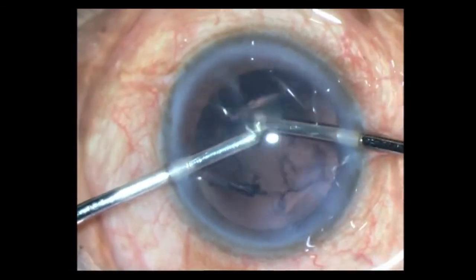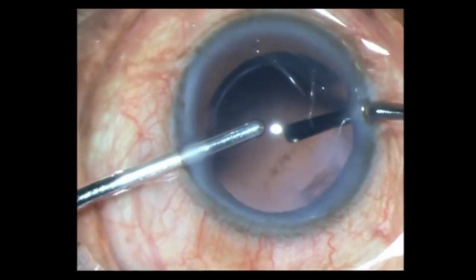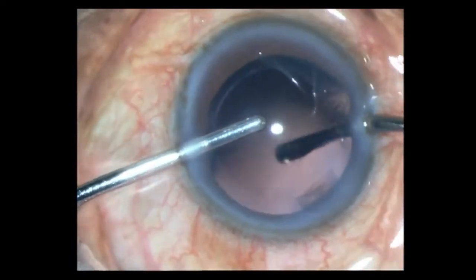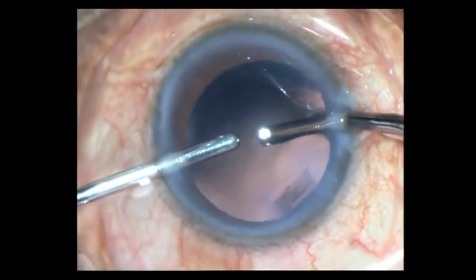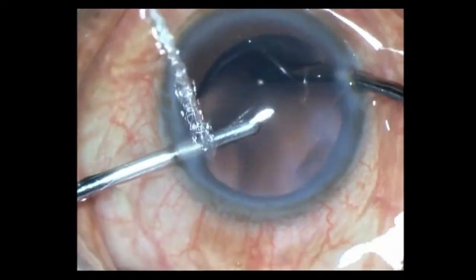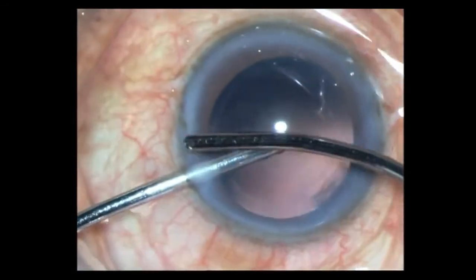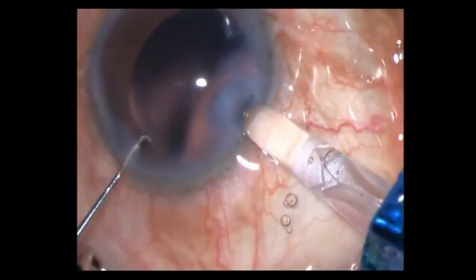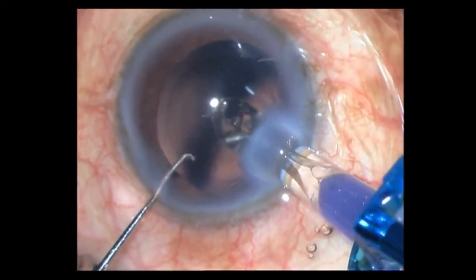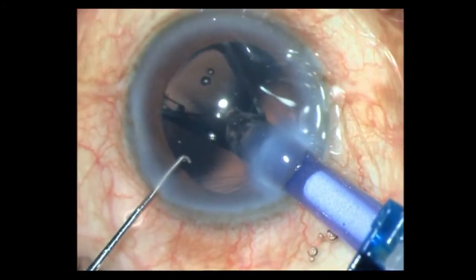There is a bit of posterior capsule opacity as well, so I am just clearing that up with my polishing parameters — that's way lower than the aspiration parameters, around 5mm of mercury and 5ml flow rate, linearly controlled. I then inject my single-piece hydrophobic IOL directly into the bag under HPMC.